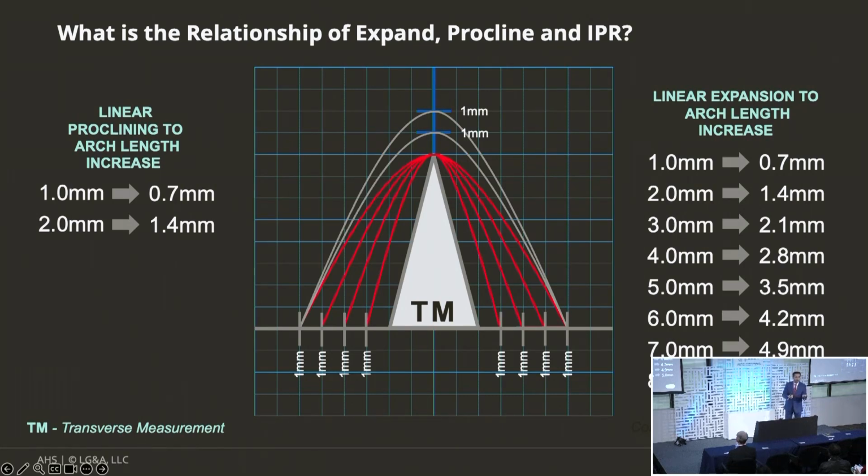Are you doing 2 millimeters of IPR? Are you doing 3 millimeters of IPR? Are you doing 4 millimeters of IPR? Anybody want to volunteer a number on their last chunk of cases, how much IPR they might be doing? A 0.5 in multiple spots? So the total might be 2 to 3? 2 to 3. Yeah, that number usually gets out there, 2 to 3 millimeters.